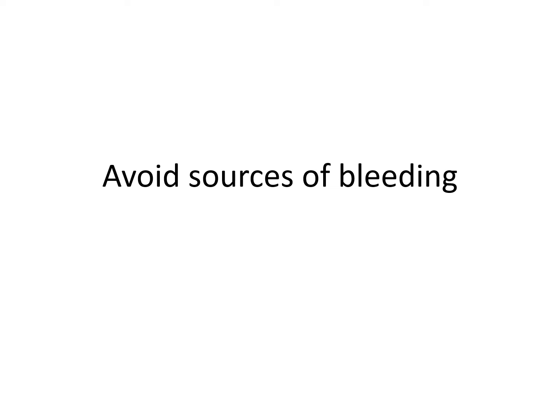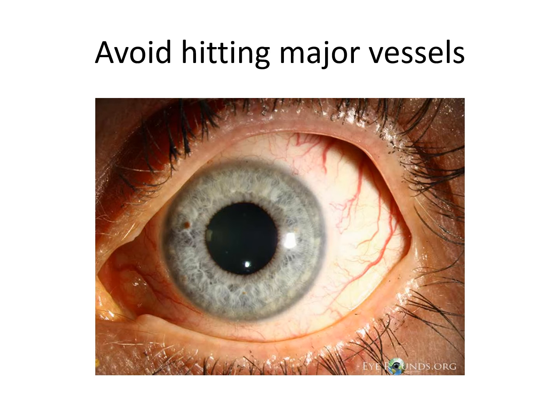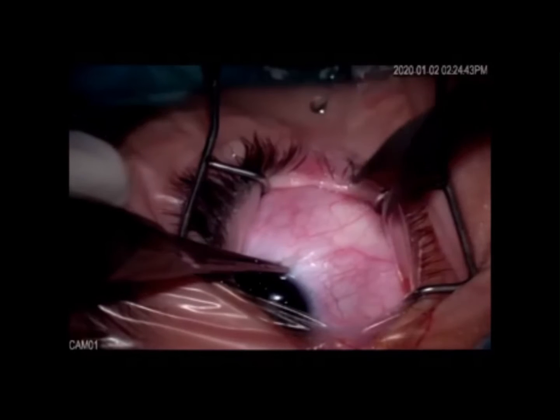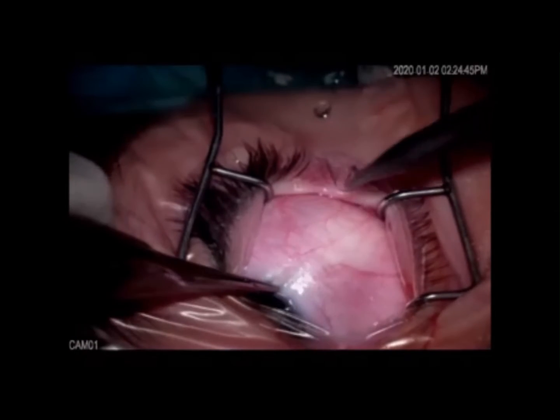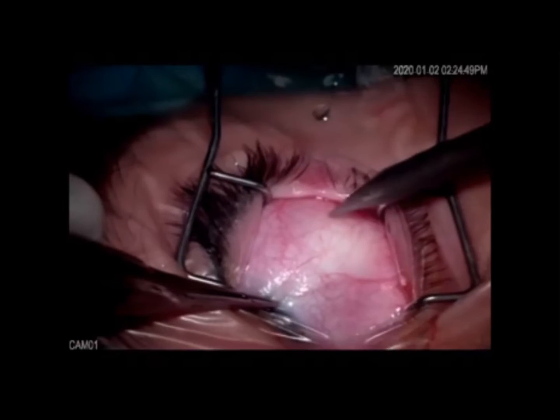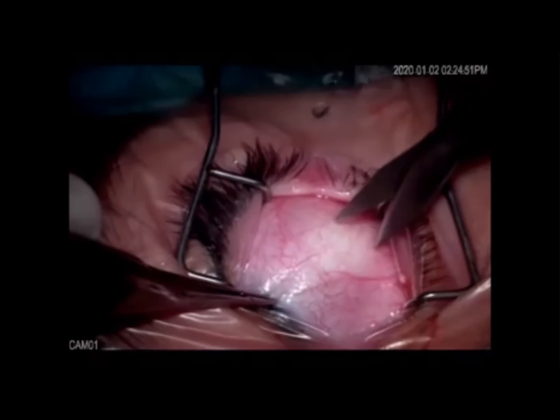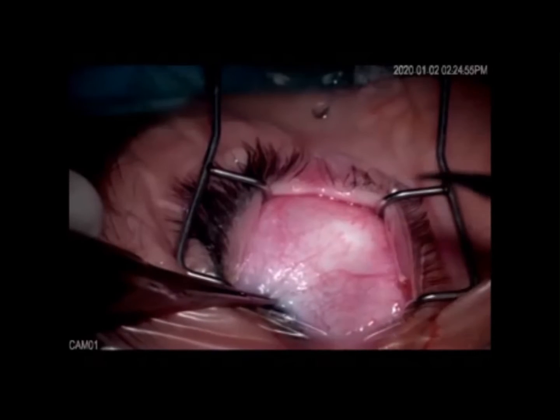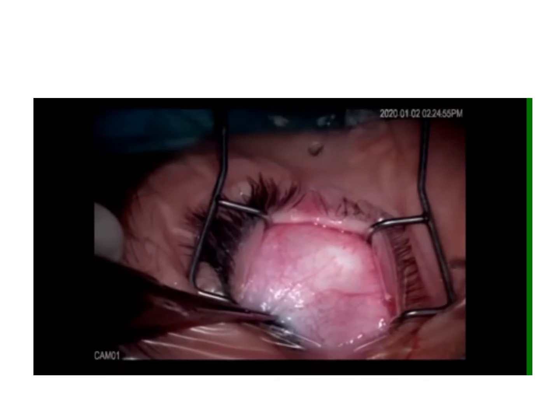You always need to avoid sources of bleeding. Always try to avoid hitting the major conjunctival or ciliary blood vessels. When opening the conjunctiva, you can see there is a pink zone overlying the muscles and a white zone in between. The incision should be made in the white zone, not the pink zone.